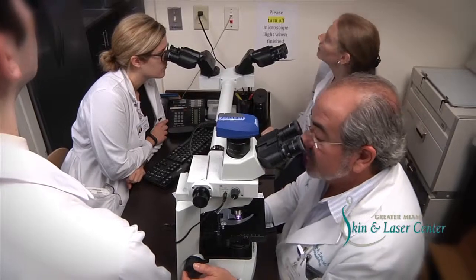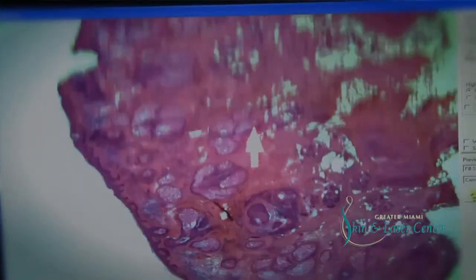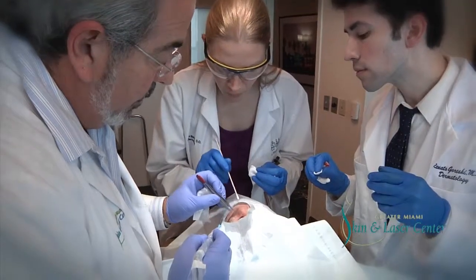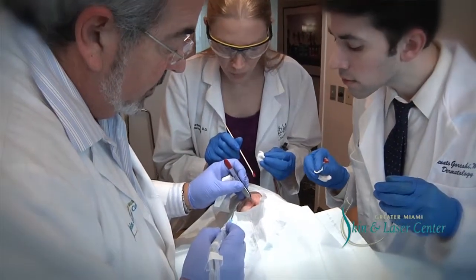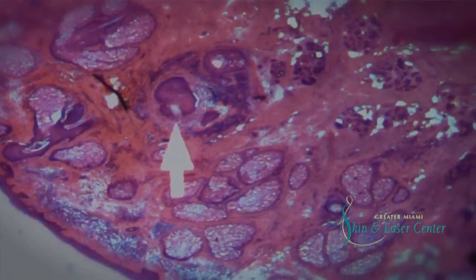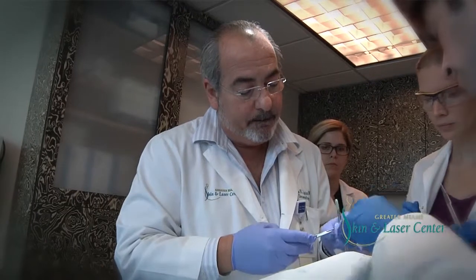Here on the microscope, what we're looking for are cells — and on the screen for some of my fellows that are watching — cells that look tumorous or look suspicious, where then we look at them more closely and decide whether they are tumor and if we need to go back and take another layer. This procedure, called Mohs Microscopic Surgery, allows the surgeon to remove the tissue, preserving the most normal tissue as possible. And with the use of the microscope, searching for cells, we can be sure that when I go back and talk to the patient, that we are tumor free and ready to go ahead and close or reconstruct the defect in order to get the best cosmetic result.